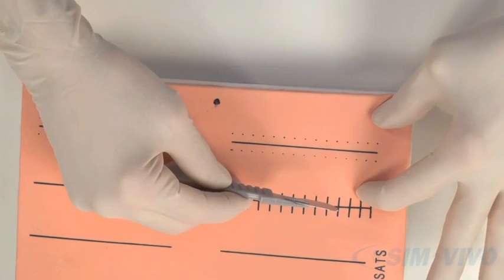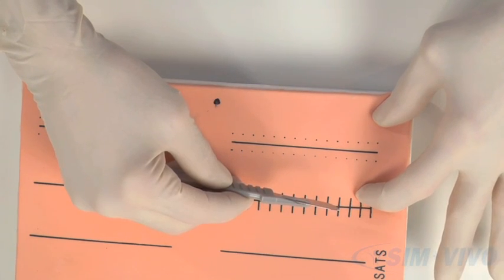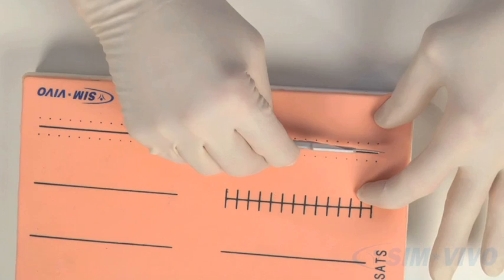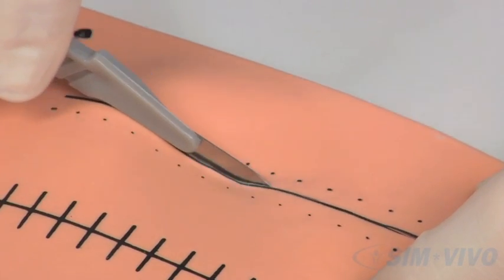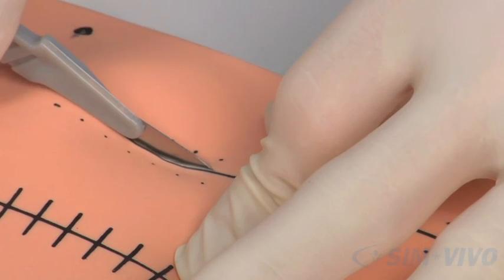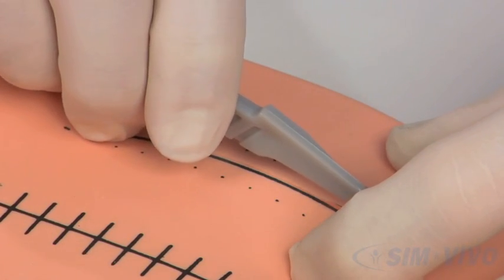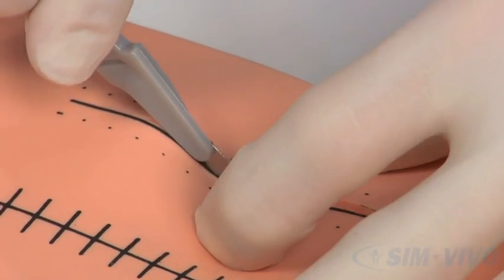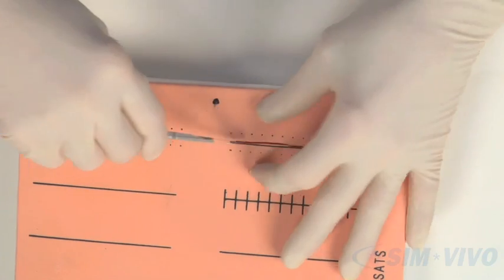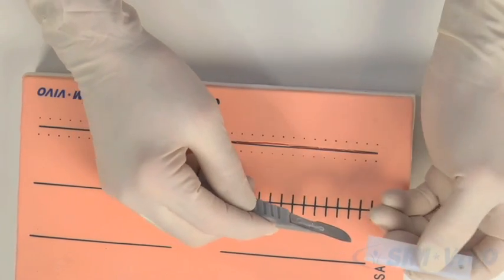In order to provide traction and countertraction, use your thumb and index finger of your non-dominant hand to spread the skin as you cut the incision. In this model, the skin is a little sticky, so it might take several strokes to get through it. When finished, carefully put the cover back on the scalpel.